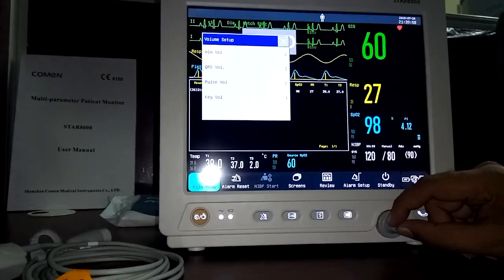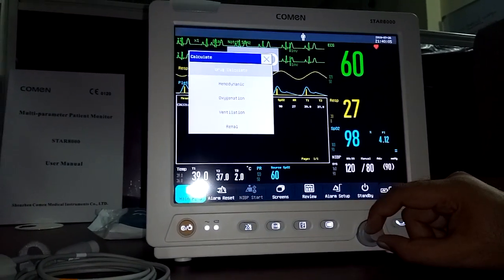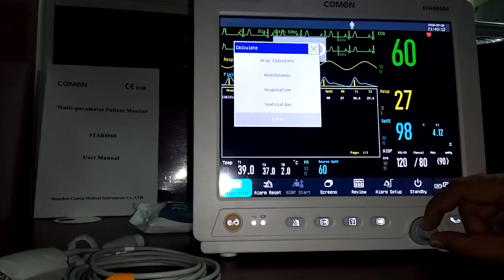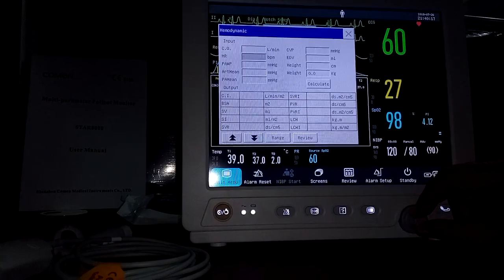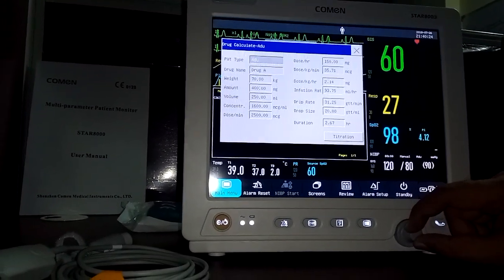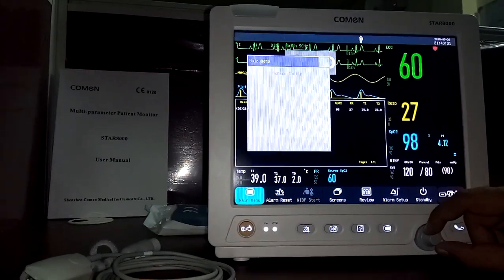Under the calculations menu, you have drug dose calculations, hemodynamic calculations, oxygenation calculations, and ventilation calculations. You can set all hemodynamic parameters under that submenu, and perform complete drug dose calculations from within this menu.